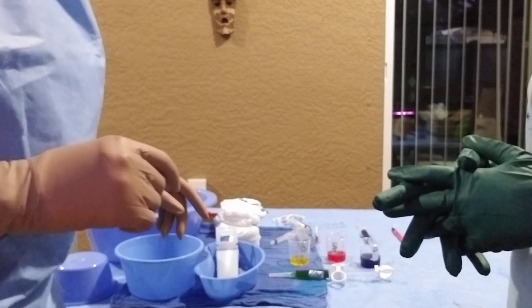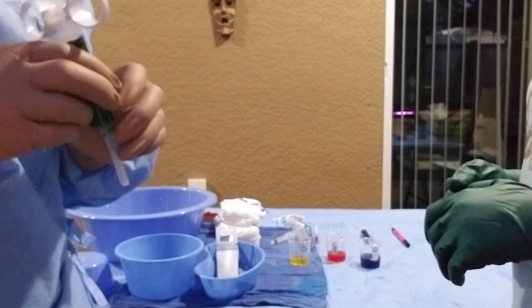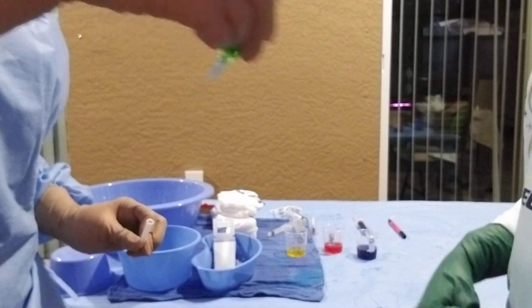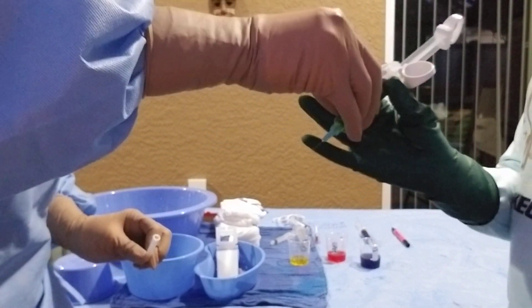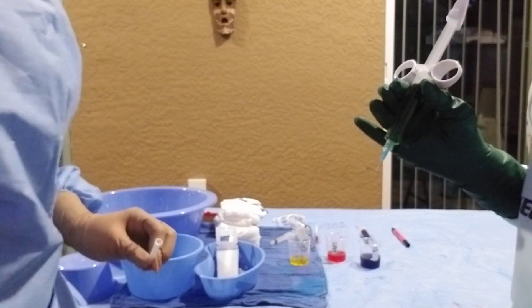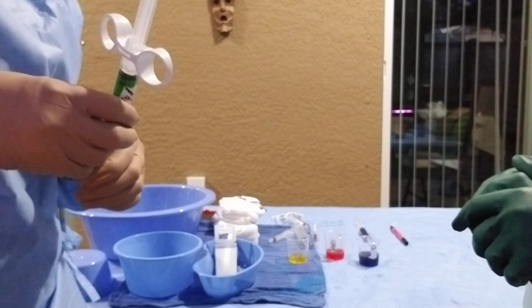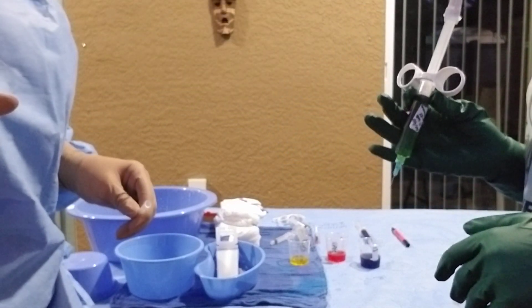Now we're going to go over passing. When passing medication, you must always hold the syringe, pull the cap off, and — fingers up away from the needle — pass it into the surgeon's hand away from you. Remove your hand quickly and then they'll move. So again: hold it, cap off, pass, and that's it.